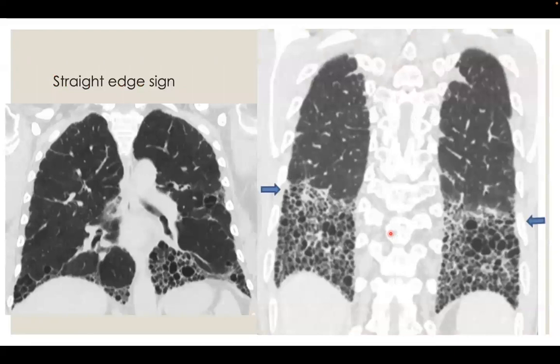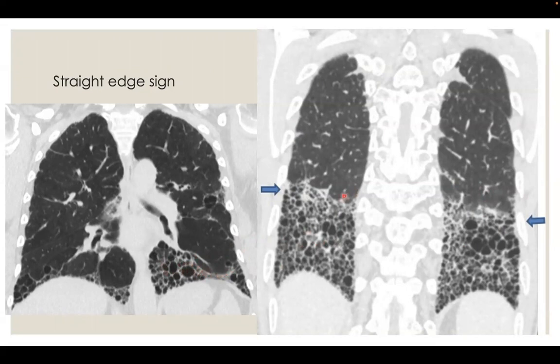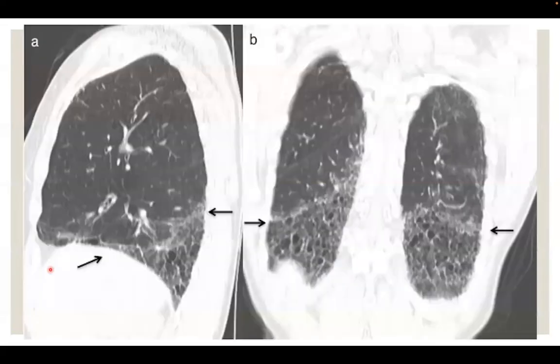Sign number four is the straight edge sign: honeycombing is confined to the lower lobes only, with no extension along the costal or pleural surfaces to the upper lobes, and there is sharp demarcation between the honeycombing and the adjacent normal lung. As seen in these two examples, honeycombing is confined to the lower lobes with sharp demarcation between the honeycombing and the adjacent lung. Another example shows the sharp demarcation and how it is confined to the lower lobes only.